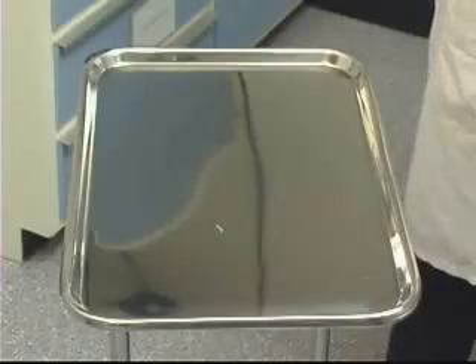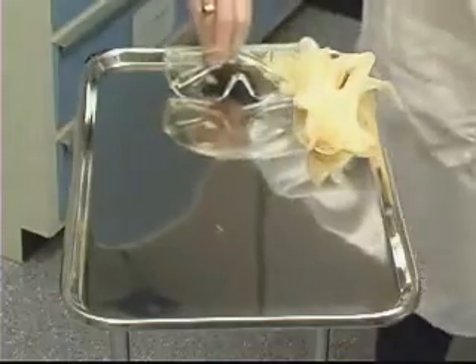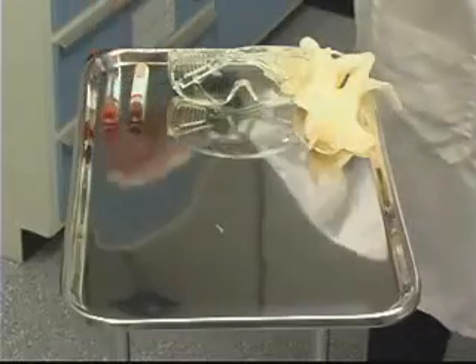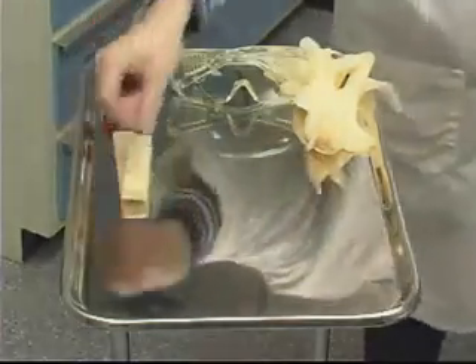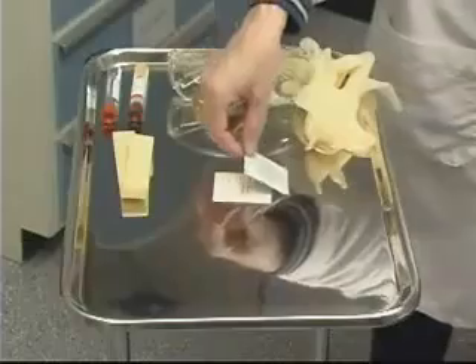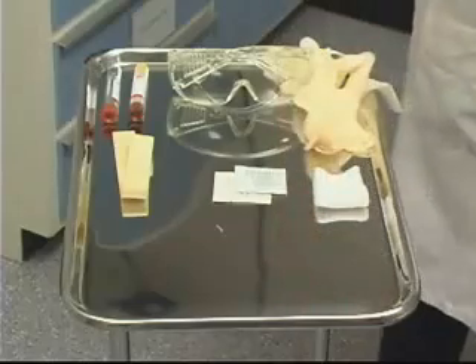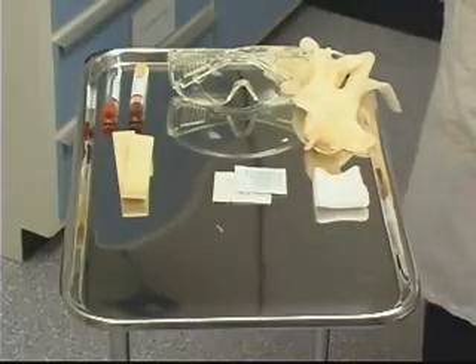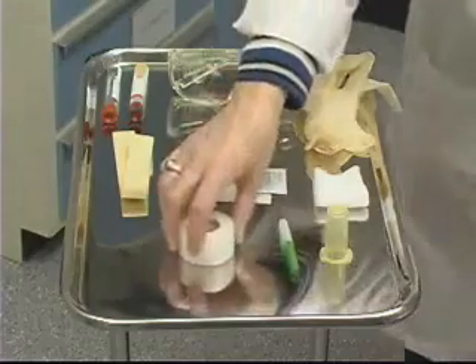Today we'll demonstrate the technique of phlebotomy. The equipment necessary for phlebotomy is as follows: protective gloves, protective eyewear, the necessary blood collection tubes, tourniquet, povidone iodine solution and an alcohol swab for cleaning the skin, a piece of gauze to cover the site after, vacutainer holder and the vacutainer needle, and a piece of tape to secure the gauze.